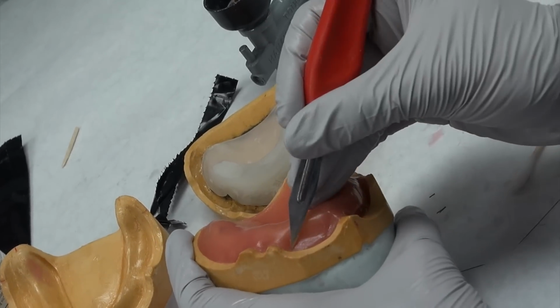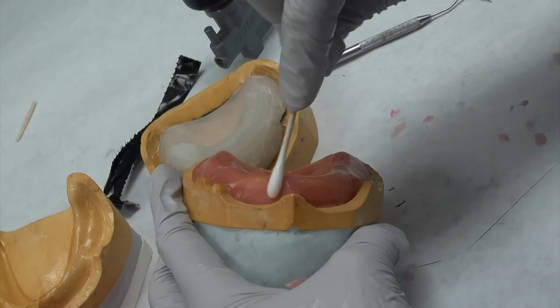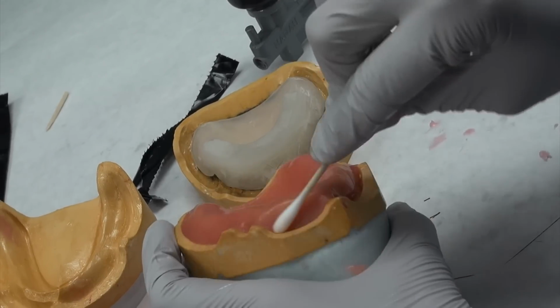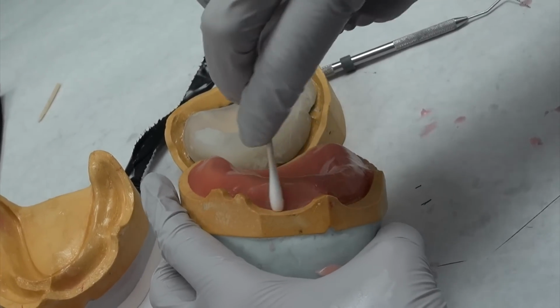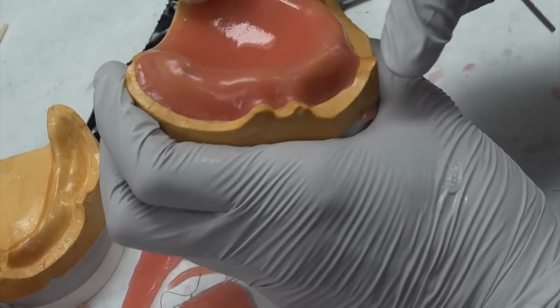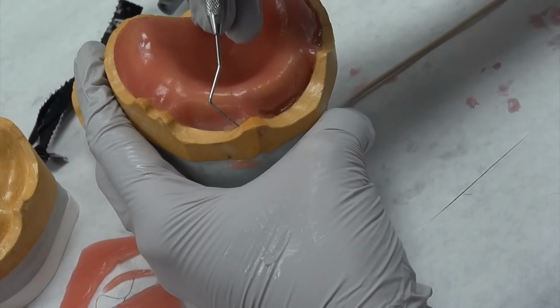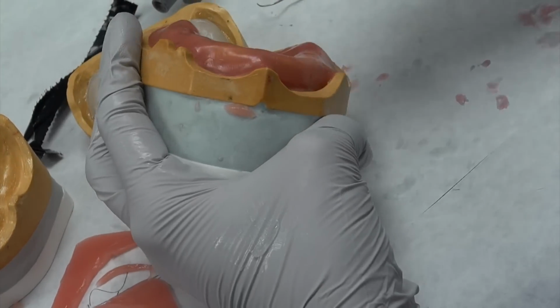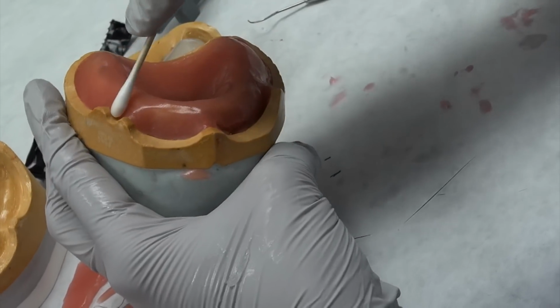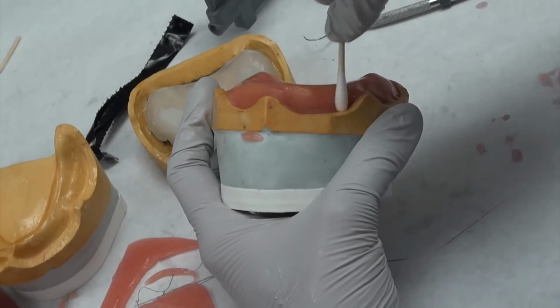And if it seems like it's too much, you can easily just take a little out. And again, just flatten it out. Stuff it into that. The most important thing is that the vestibule is full and that it comes all the way to the peripheral edge. The peripheral edge is this edge right here, okay? And so we'll just do that all the way to the end.